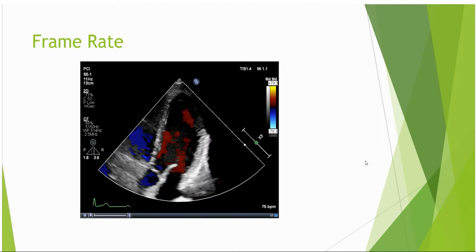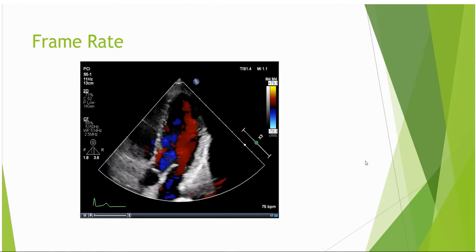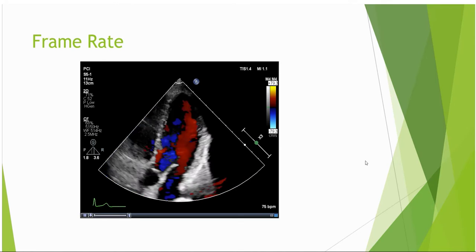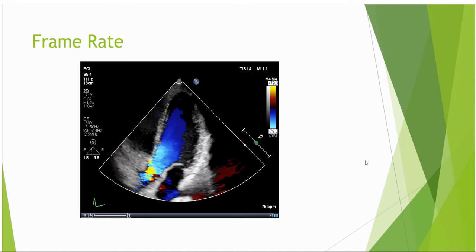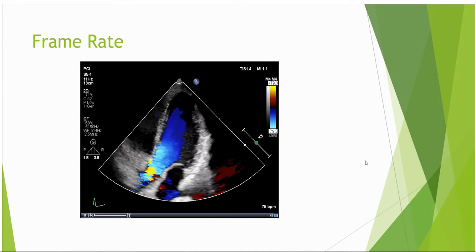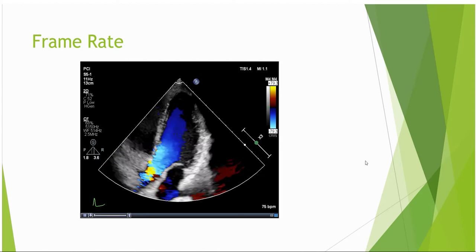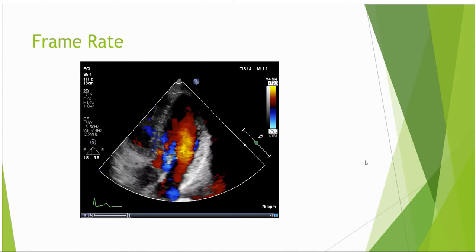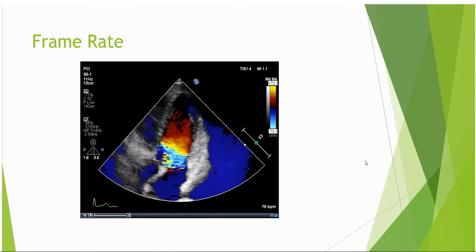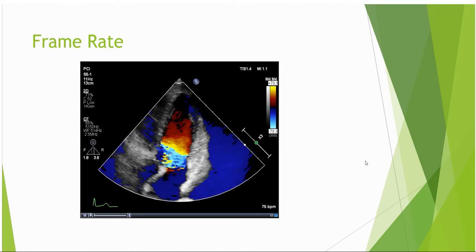Introducing a second imaging mode will decrease frame rates. One of the most significant impacts that can be made to 2D frame rates is by turning on color Doppler. The system must alternate between 2D and color beam formation. Frame rates as high as 100 Hz can easily be trimmed to 20 Hz or lower. Here, the temporal resolution can be impacted significantly, so much that brief color flows or fast motions on the 2D image could be missed as the system can't sample the field of view with the frequency required.